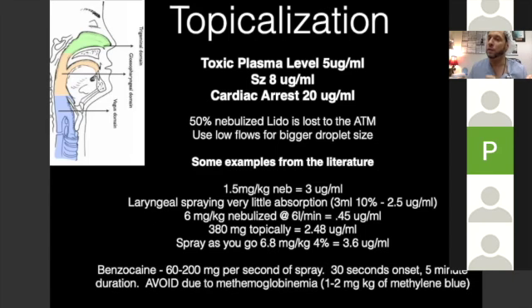The dose of these sprays is a 1-second spray. So you want to grab the tongue, pull it to the side, see the palatoglossal arch where the 9th nerve is, and do a 1-second spray on each side. Before I do 7 EGDs today, some of the really sick ones, I'll grab their tongue with some gauze, pull it to the side, then the other side. That will get the 9th nerve, because the 9th nerve supplies the posterior third of the tongue to the vallecula.